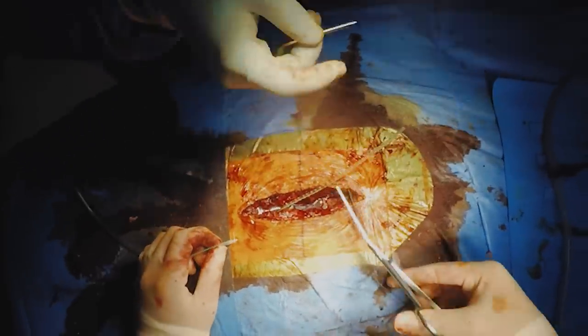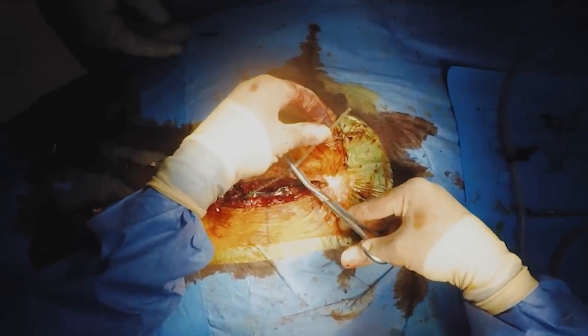After that, we'll stitch up the muscles, fat and skin and take the patient back to recovery or the ward or intensive care or wherever they came from.